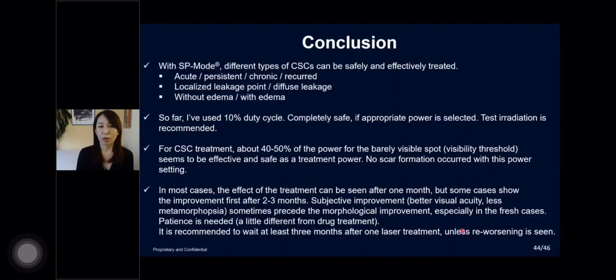So now cases 1 to 3 are finished. I want to show you the conclusion of all cases. With SP mode, different types of CSC can be safely and effectively treated. For example, acute, persistent, chronic and recurrent cases, and localized leakage points or diffuse leakage, without edema or with edema. Of course, the difficulty is different, but every case can be an indication.